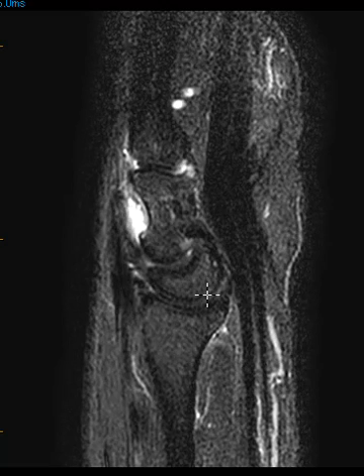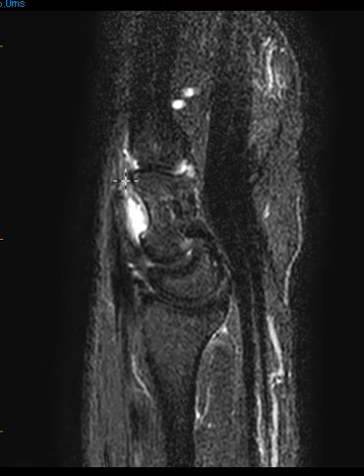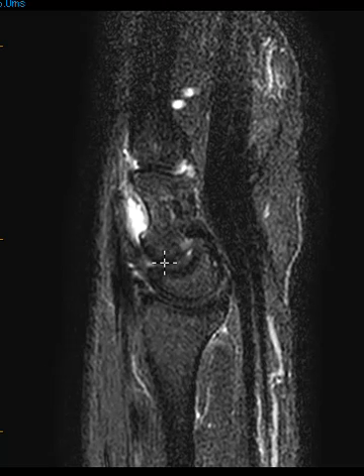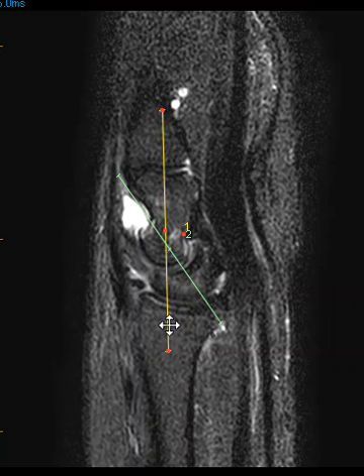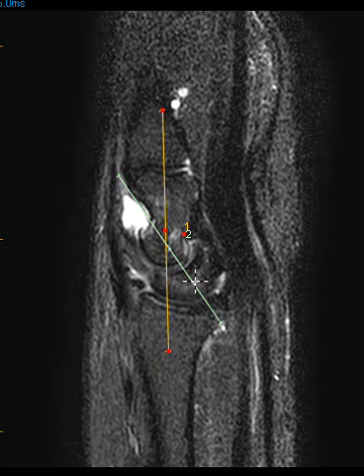There's an angle from the lunate bone that's going backwards here. The angle between the lunate bone and the capitate bone should be less than 30 degrees, and this patient is more than 30 degrees — this angle is about 35 degrees. This is called the capitolunate angle.